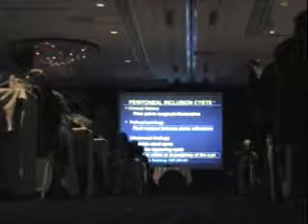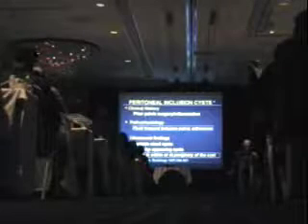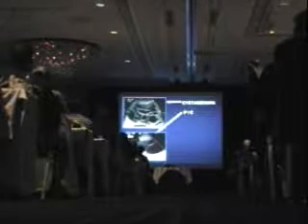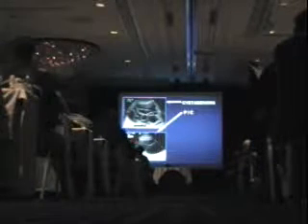The trick to making this diagnosis is, first, you want to know the history, that there's been previous surgery or inflammation in that patient, and you want to find the ovary. So here are 2 different patients. This woman has something bad. This is a peritoneal inclusion cyst.